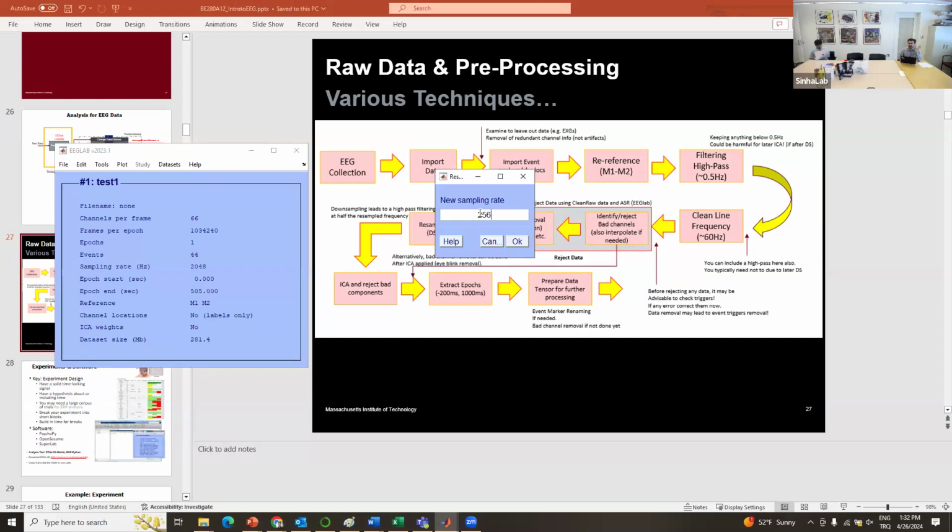To avoid these aliasing phenomena, you need to choose your sampling rate such that the maximum frequency useful to your processing is at most half the sampling rate. So 256 probably is also okay, because I would not expect information to be contained above 128 hertz. Most likely my information would be residing between 0 and maybe 80 or 70 hertz.